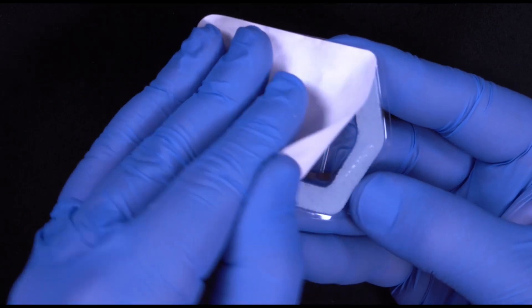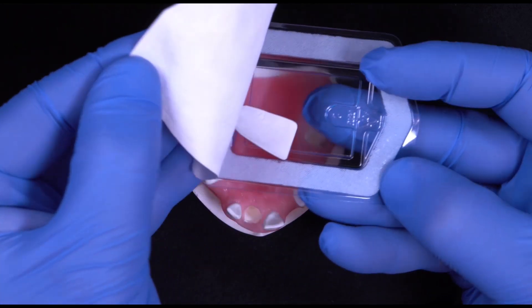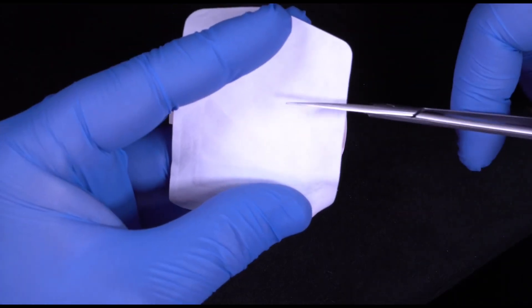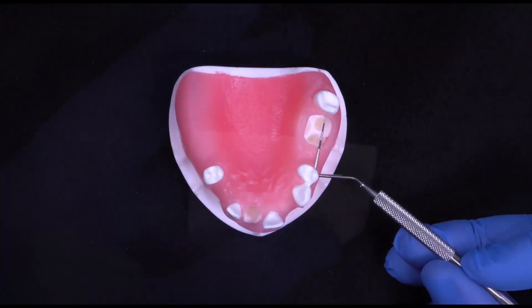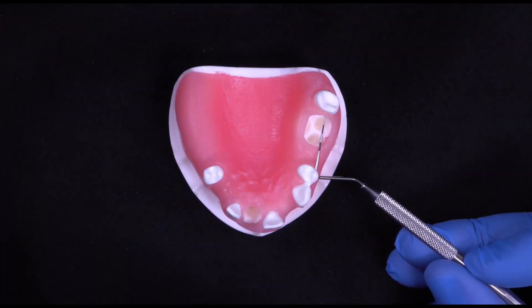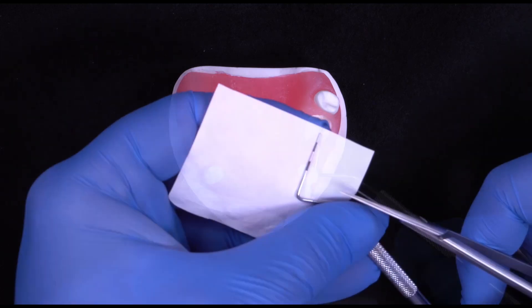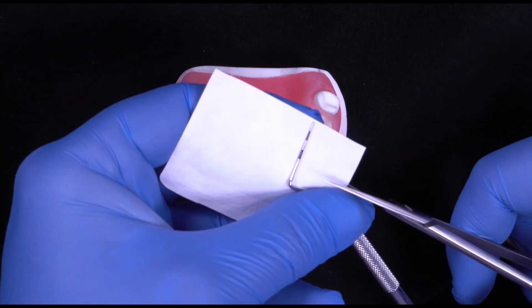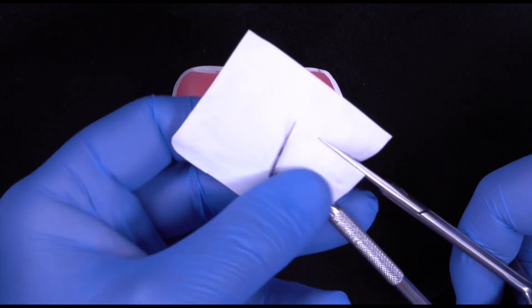Using the internal packaging of the Creos Xenoprotect collagen membrane, a template of the membrane size and shape can be created by transferring the measured size from the extraction site to the template. This helps improve the trimming of the membrane to the ideal size.